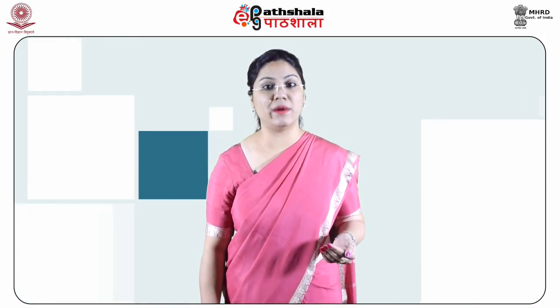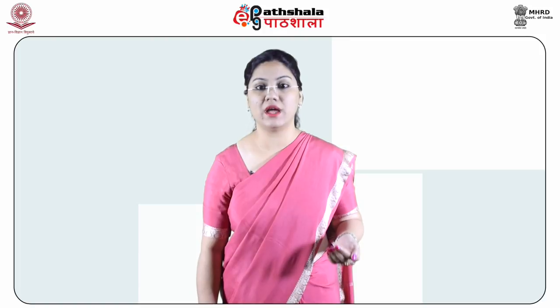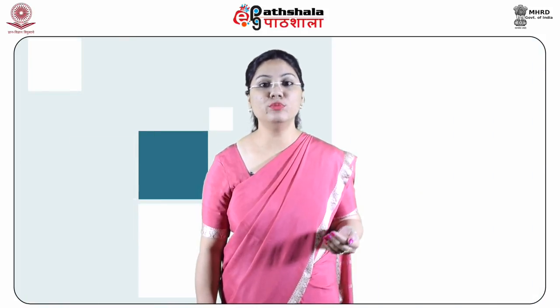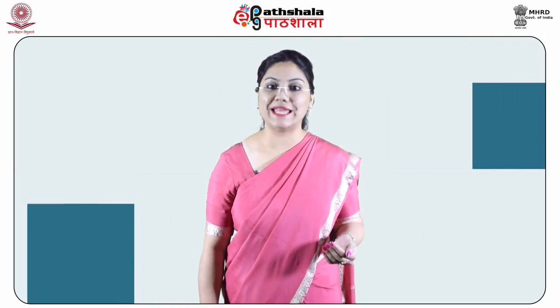There are some problems related to the use of MRI. The MRI image is susceptible to movement artifacts, and requires accurate calibration of head position from the neurologist and absolute stillness from the patient during scanning.